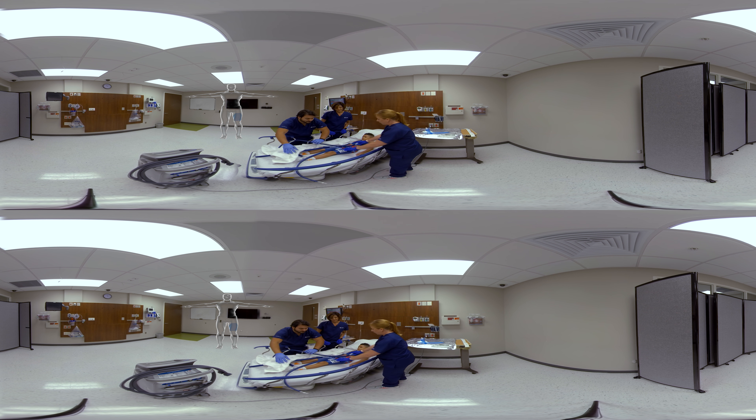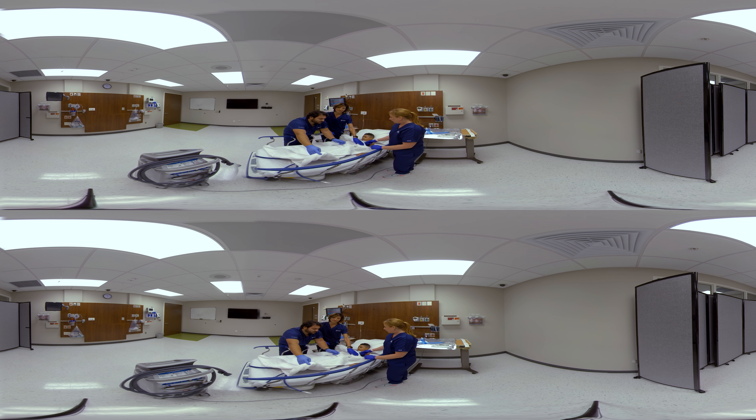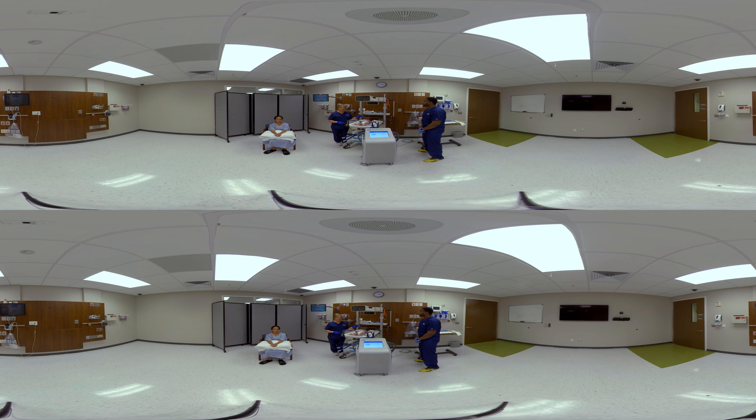Ensure that the pads are not too tight to allow for full respiratory excursion. Check the skin according to your hospital protocol for areas of chafing and readjust the pads accordingly. The pads are meant to be readjusted for up to five days on each patient. Now that we have our patient positioned on the Arctic Sun gel pad, we're going to also place a core temperature probe — either an esophageal or rectal probe — and then connect it to the temperature cable on the back of the device.